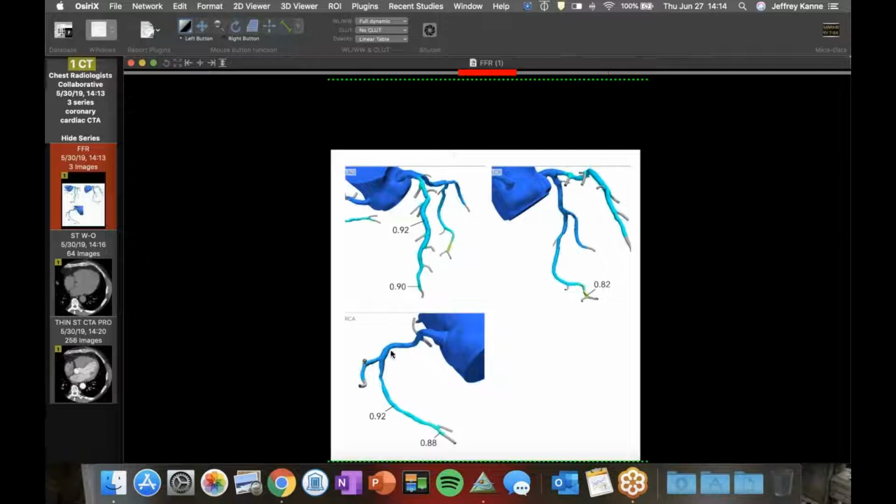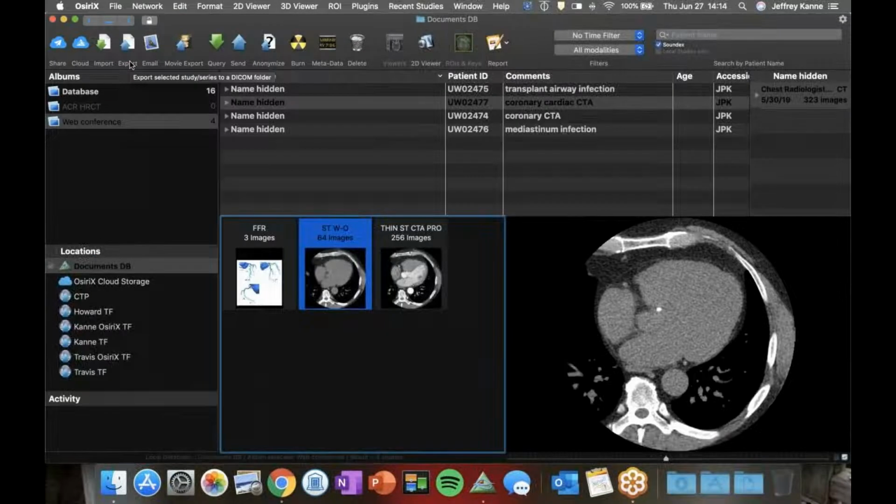Okay. Yeah, and you can see in these images how it slowly drops as you go more distal. So I think it's coming along, but we're doing more of it and getting more experience with it. Okay, I'm going to turn it over to Howard now. There we go. That's all you, Howard.